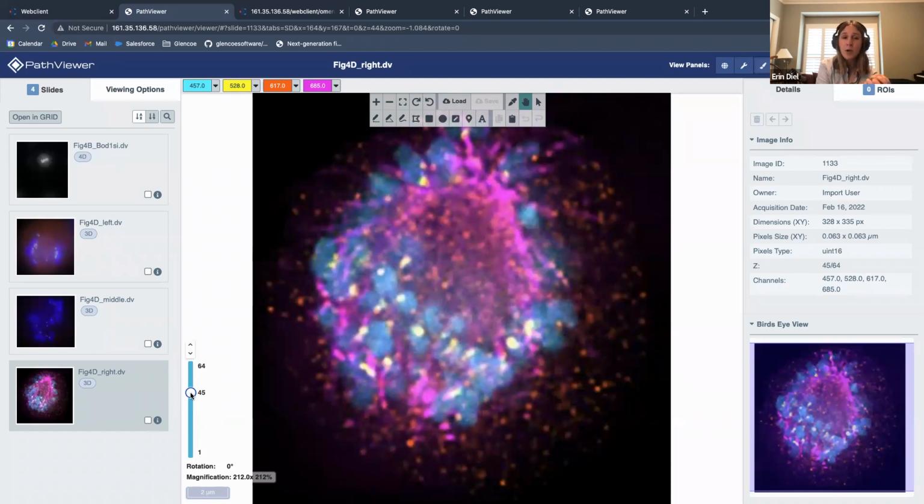There is a viewer called OMERO FP Bioimage. This is an open source plugin for OMERO using the FP Bioimage viewer that will give you a nice sort of volume rendering of this object. At Glencoe, we don't support it, not that we don't support you using it, but we're not maintaining and developing that. But it's certainly something to look into. And the other thing you could explore is things like the OMERO Fiji connector, where there are, of course, a lot of interesting volume-based viewers. And so with that Fiji connector, you can open up images from OMERO in Fiji and then use whatever plugins you want.